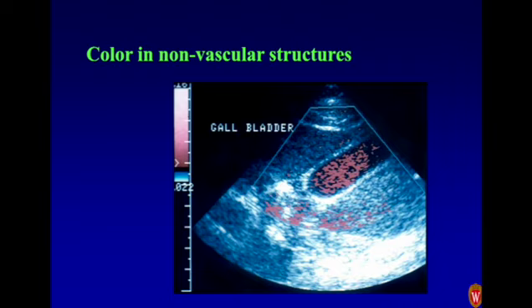It's going to assume either motion of the transducer in your hand or maybe the patient's breathing. But if it's a dark reflector, it will assume that this motion is real, such as a red blood cell moving in a vessel. And so, what do you think of this? This is a gallbladder. Okay, is there a cholecystic arterial fistula here? You know, it better not be.